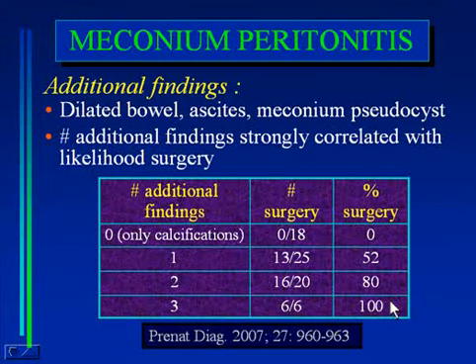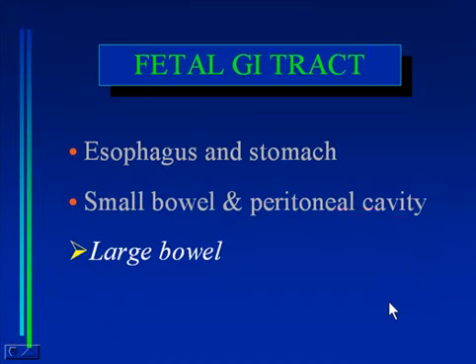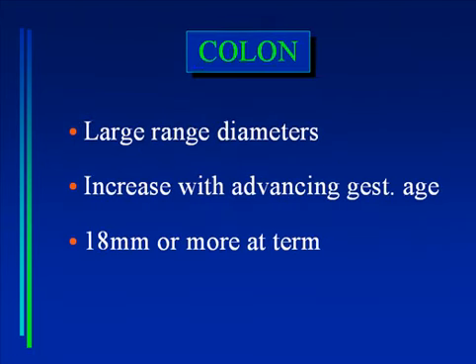And if all 3 findings were present, all of the fetuses needed postnatal surgery. With that, we'll close by moving on and talking about the large bowel, the colon and the rectosigmoid.